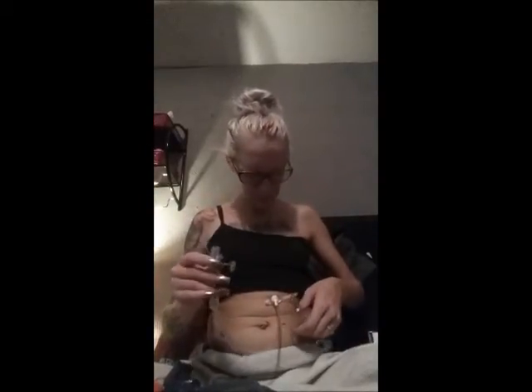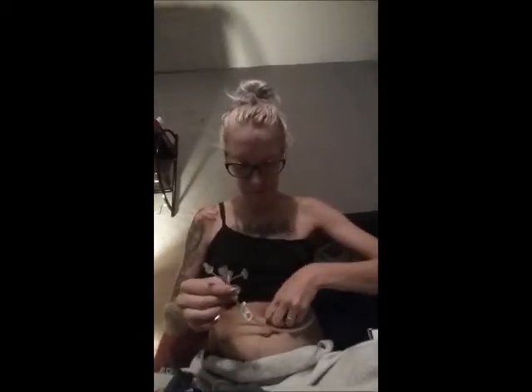I have had a few accidents where the end of the feeding bag has come out of this part because I rolled on it in the middle of the night, but that was years ago when I first got it, and I haven't had any issues since, especially because I don't fall asleep with my feedings now. But other than that, that's the regular extension.